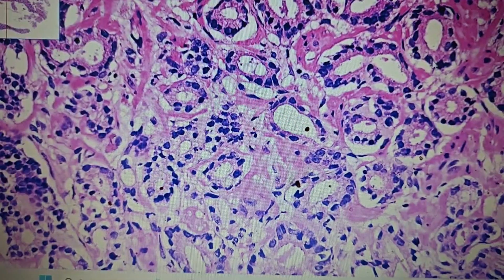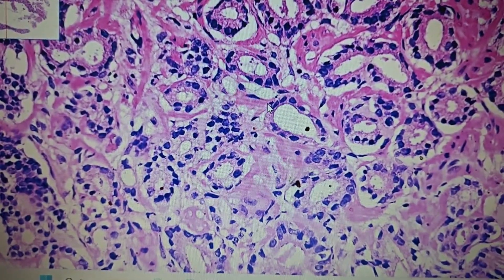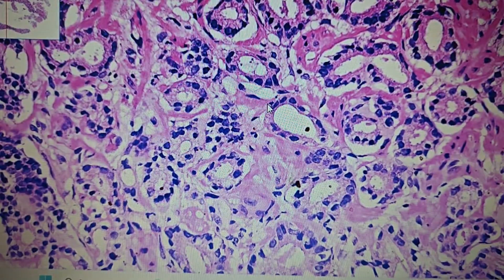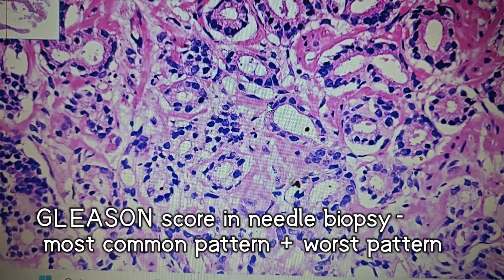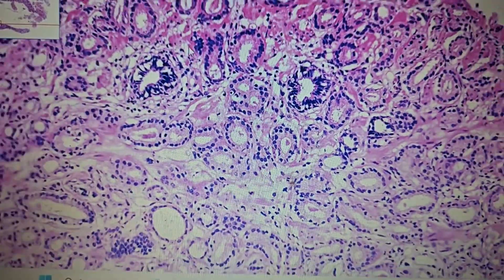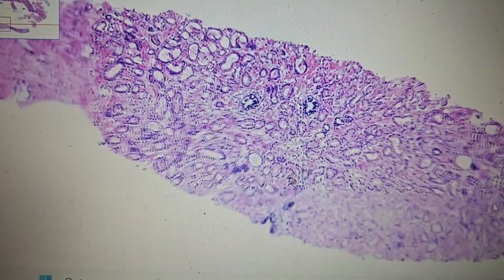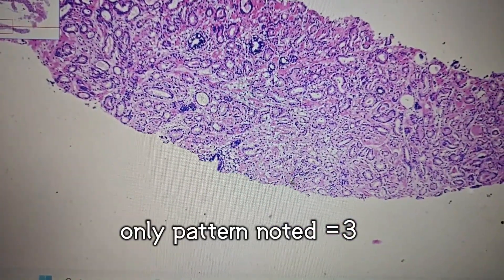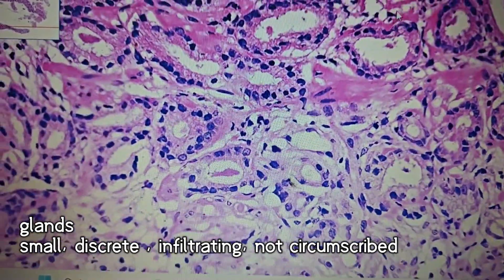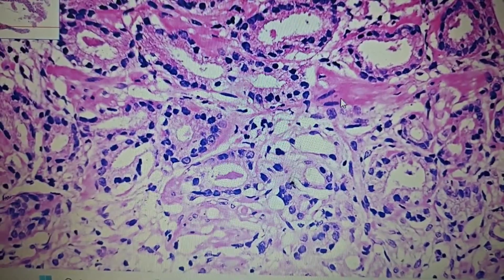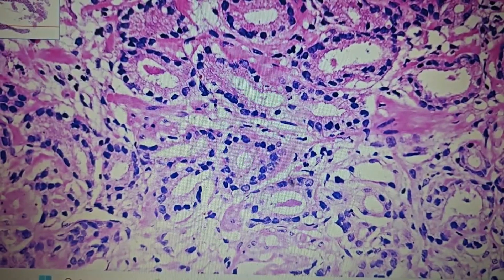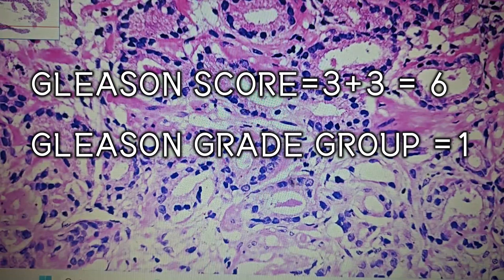If these glands were fused with no intervening stroma, we would give a pattern of 4, but here the stroma is present, so we give Gleason pattern 3. In the needle biopsy specimen, for Gleason scoring we follow the rule of scoring the most common pattern followed by the worst pattern. In this needle biopsy specimen, there is only a single pattern — pattern 3 — with small, discrete, crowded infiltrating glands separated by some stroma. So we give a Gleason score of 3+3.